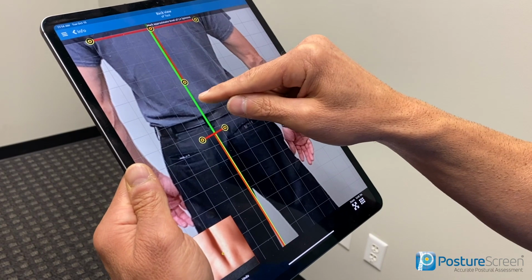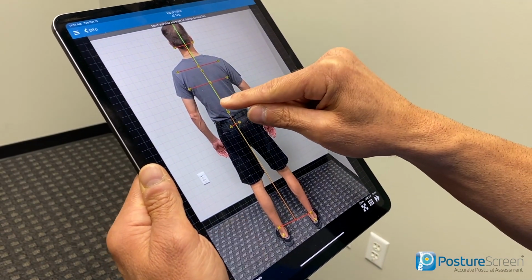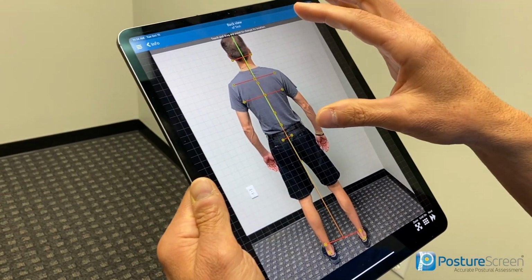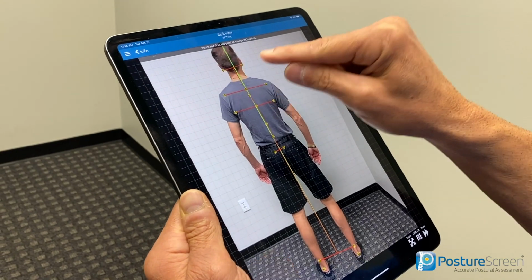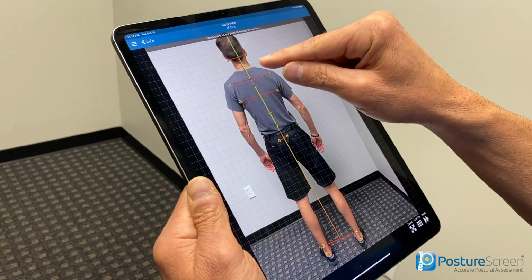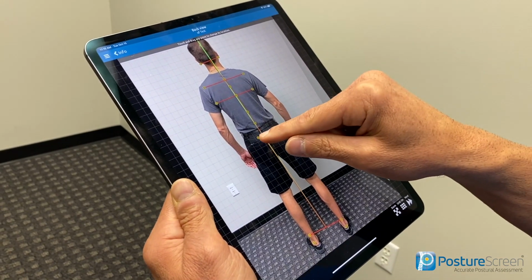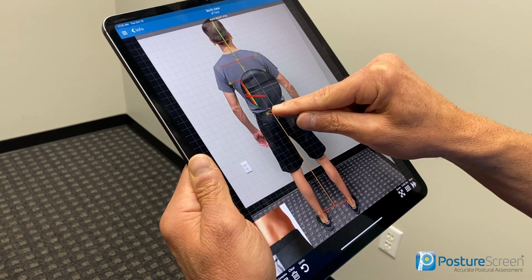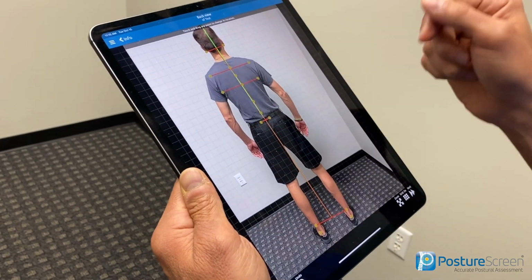So on this part, we're going to go ahead and hit next again. Now, if I need to move this up or change any of these points, obviously if they have the shirt off and this is a more detailed evaluation, you could even pre-mark some of these points. I can't see any anatomy because he has his shirt on, so I'm just guessing here. His PSISs, here the computer got a little confused, so we're going to just move those points up just a little bit because his PSISs are probably up in this region, okay?